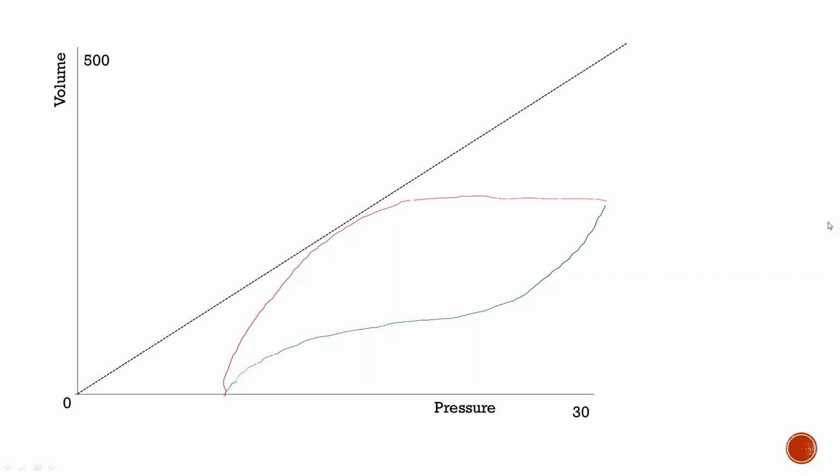Is this normal, abnormal, or why? Anybody, it's fair game. Abnormal, okay, why? You shouldn't level off in the volume that you're receiving relative to the pressure. Somebody said COPD. Is this COPD? Yeah, exactly.